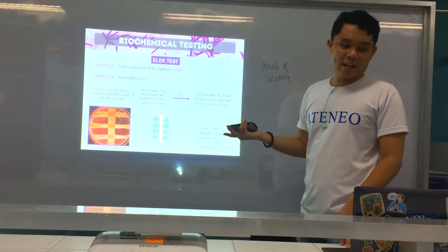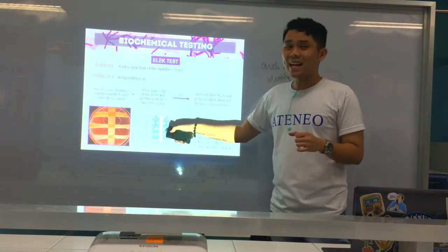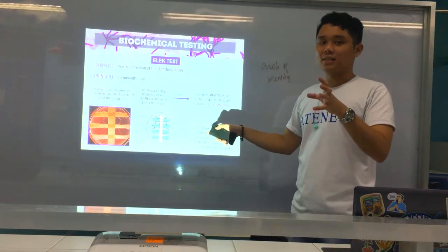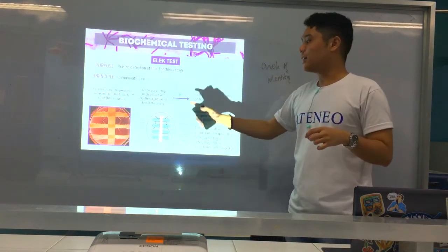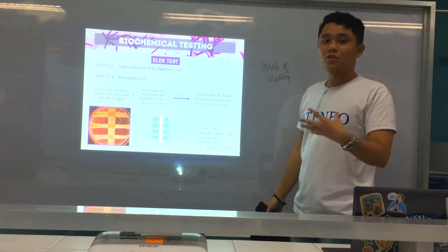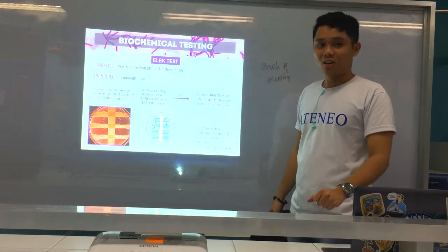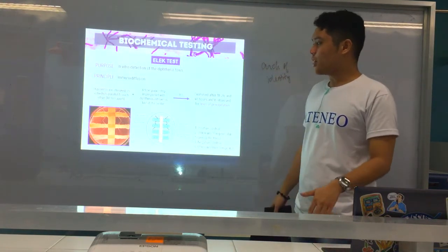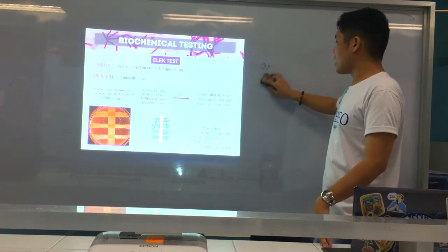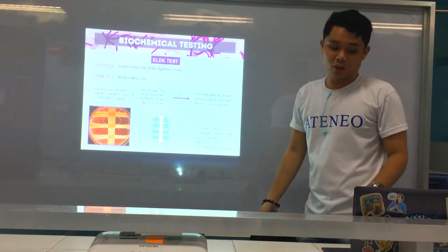That's why we call it arc of identity because in a way, you're confirming the identity of the unknown organism. You're confirming its identity na same siya sa positive control, which is known already na mo-release siya ani na toxin. Okay? In this case, the diphtheria toxin. Alright, that's the Elek test. Usually used for C. diphtheriae and again to detect if you have the diphtheria toxin.